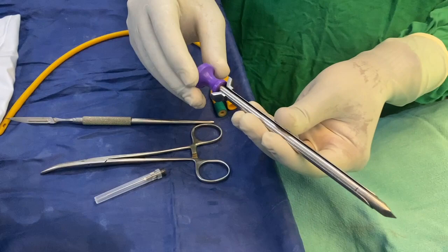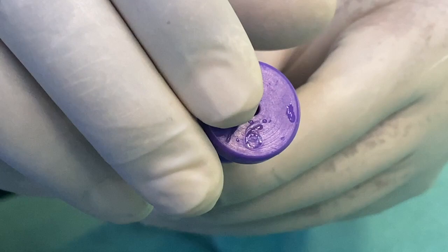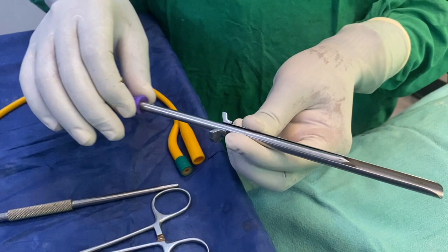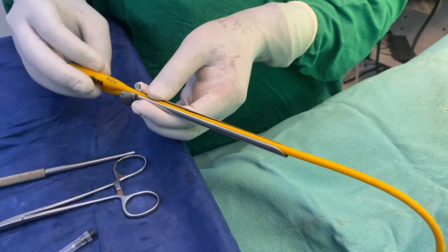The important item in this setting is the trocar and cannula. This is a half trocar — it is a half trocar because the balloon channel from the catheter will come out through this. The trocar I am using right now is a 16 French trocar. Through the 16 French trocar a 16 French catheter would go, but we usually put a 14 French catheter through this trocar so that things are easy. It is always better to confirm that the catheter goes through the cannula before the procedure so you have no trouble intraoperatively. We have confirmed the catheter goes easily, and the importance of this channel is that the balloon catheter can come out through it.